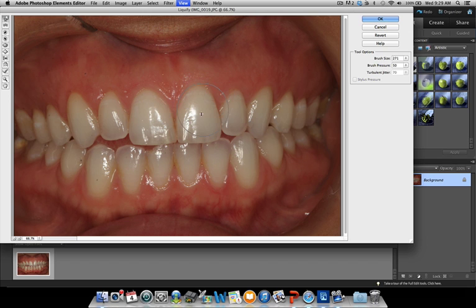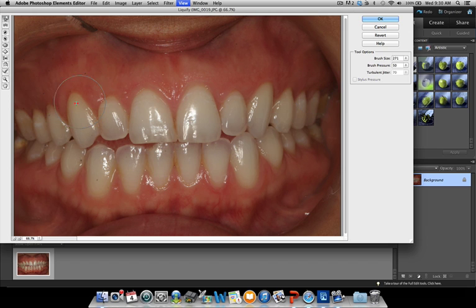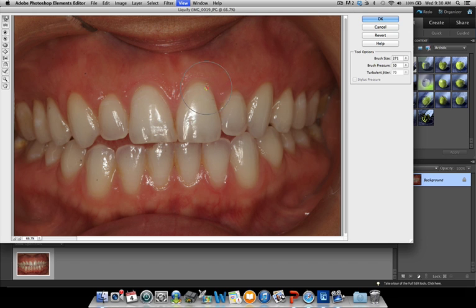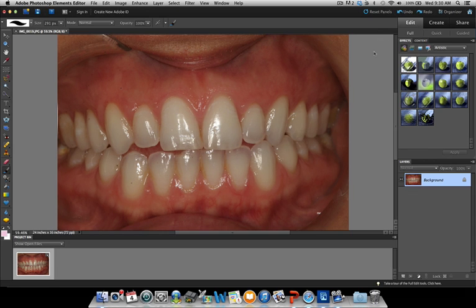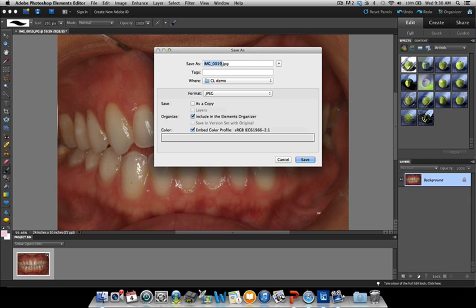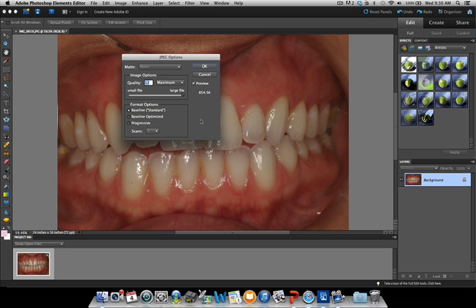If you want to change the incisal edges, that works as well. You can move the gum margin in different directions. If you made a mistake, you can undo and bring it back down. You can also do crown lengthening on posterior teeth, and it's really going to help you understand how the final result will look — or maybe it'll make you decide not to do it because it doesn't look good on the simulation. Once you're done with the digital crown lengthening, press OK, then save as — on Mac that's Shift-Command-S. Add the word 'simulation' to the file name, and save at maximum quality and resolution.